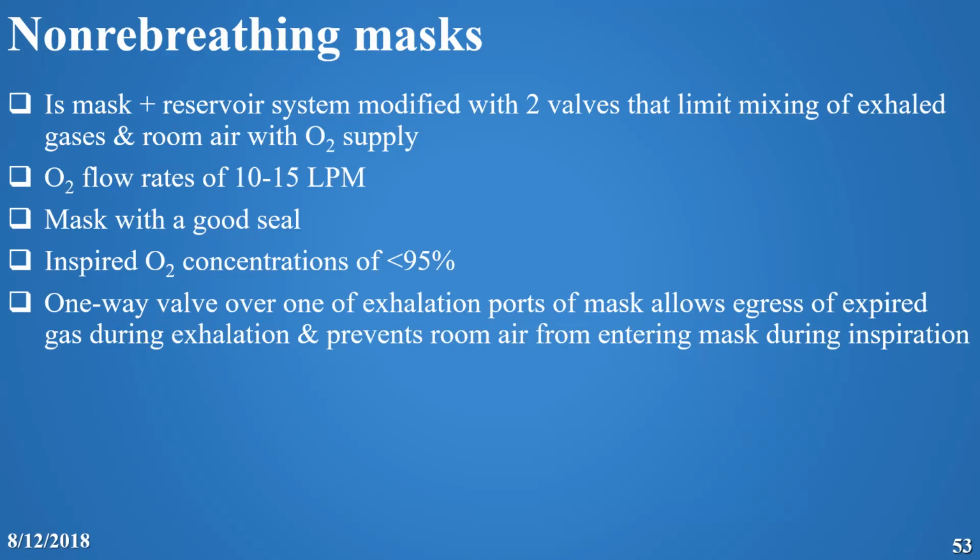The non-rebreathing mask is a mask with a reservoir, but either the opening of the exhalation port is closed or there is a valve to control them. And these valves allow the air to go out, but never allow the air to go in.